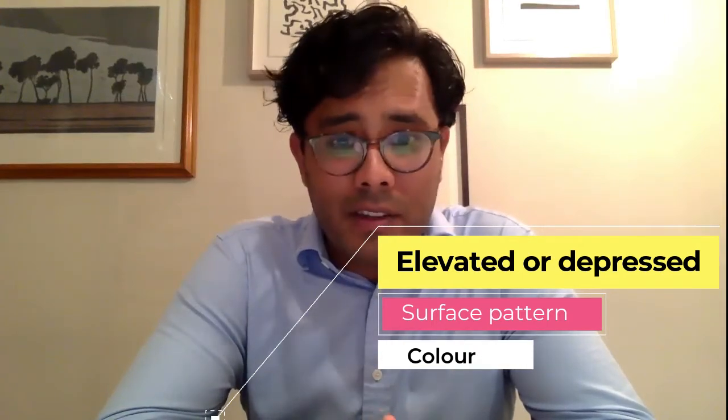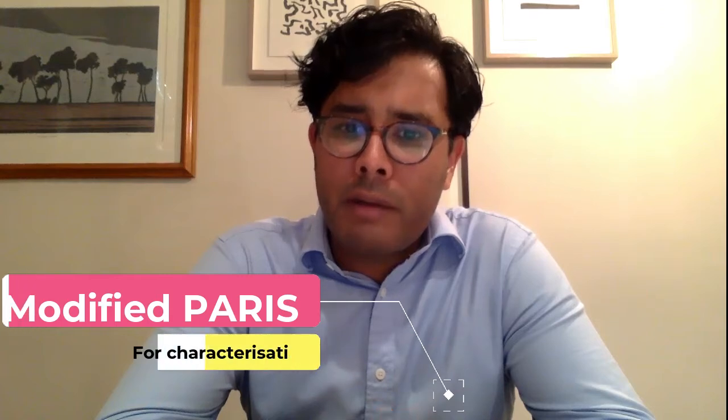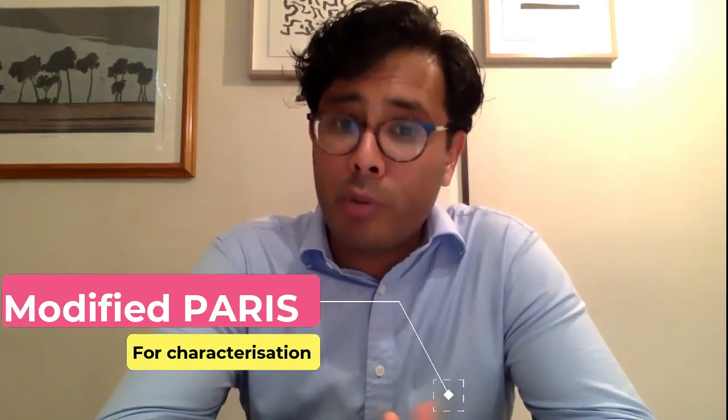Once you've suspected dysplasia, it's then important to characterise the lesion, and using a more concentrated spray of the dye can help with this. We no longer use terms such as DALM or sporadic adenomas, and instead, if visible dysplasia is found, characterise the lesion initially by its morphology. Use the modified Paris criteria to describe whether it's polypoid or non-polypoid, and whether there are features such as a depressed area that might represent a higher risk of deeper submucosal invasion.